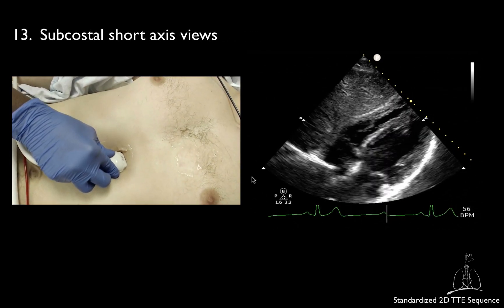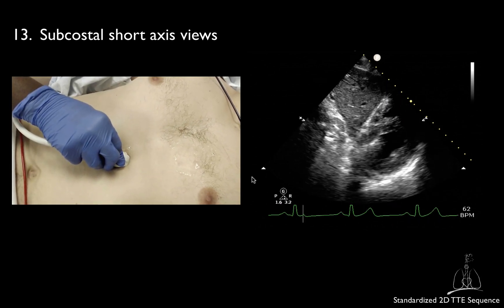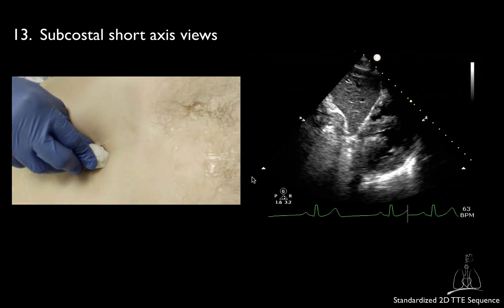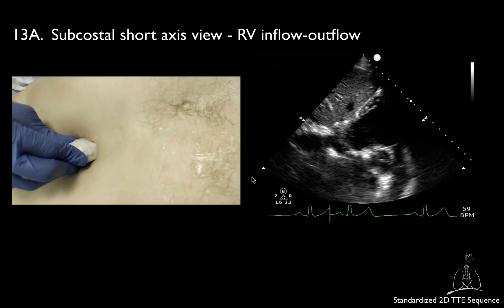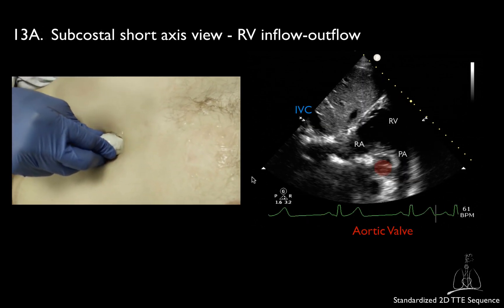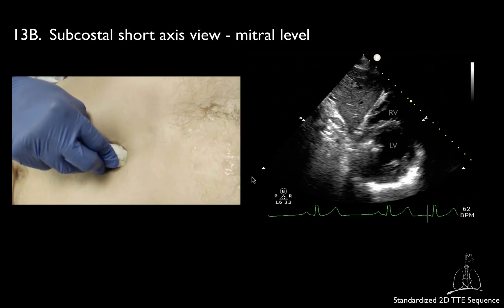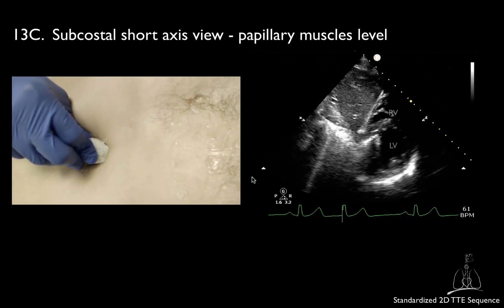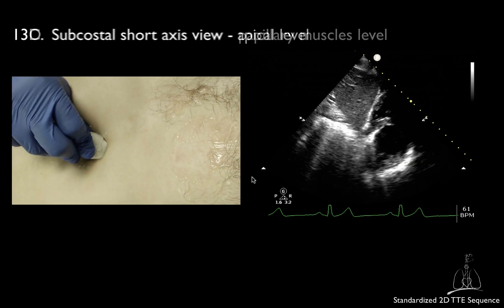When parasternal views are of poor quality, short axis views can be obtained from the subcostal window, but from a different perspective. Tilting the transducer from the patient's right to left will allow you to obtain the right ventricular inflow-outflow view, the short axis of the mitral valve view, the midpapillary view, and the view of the apex.